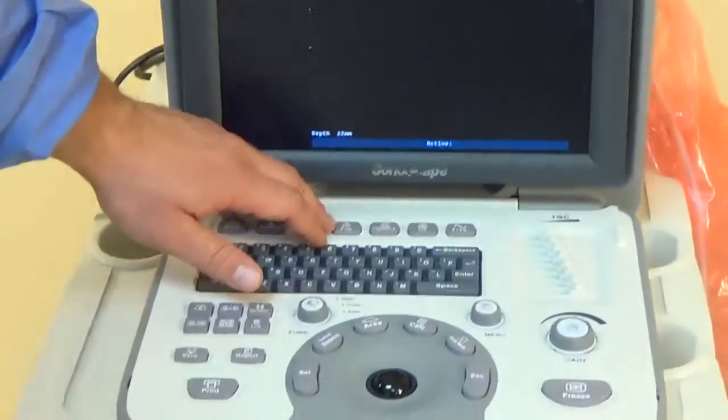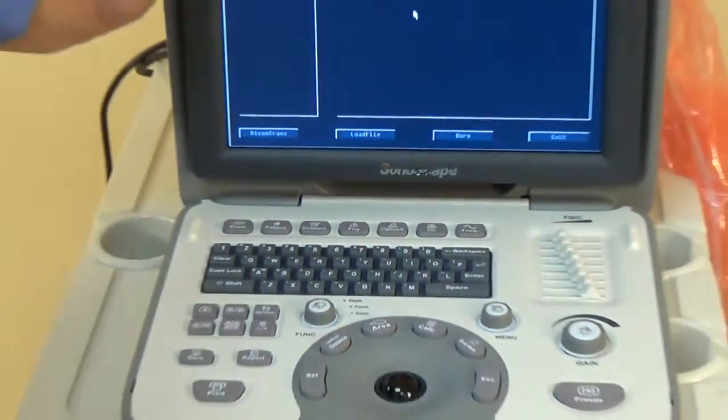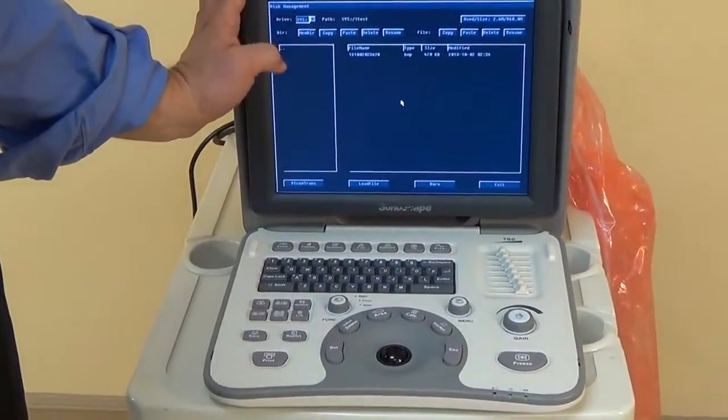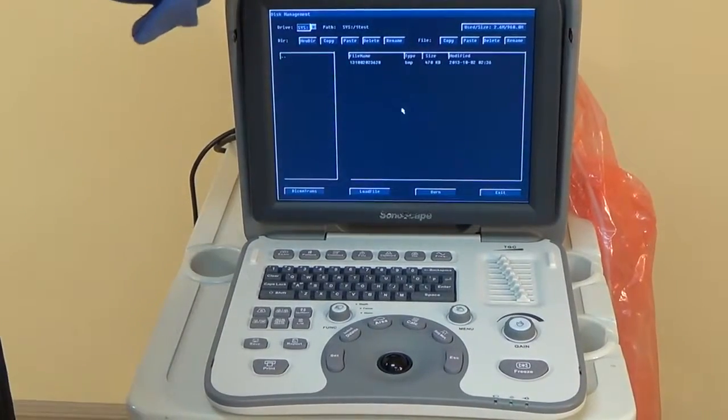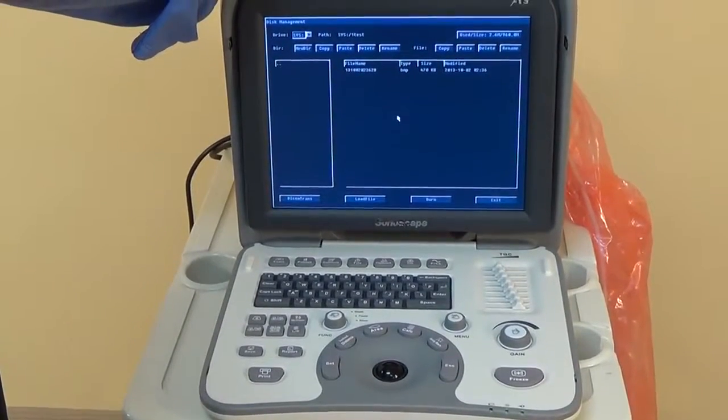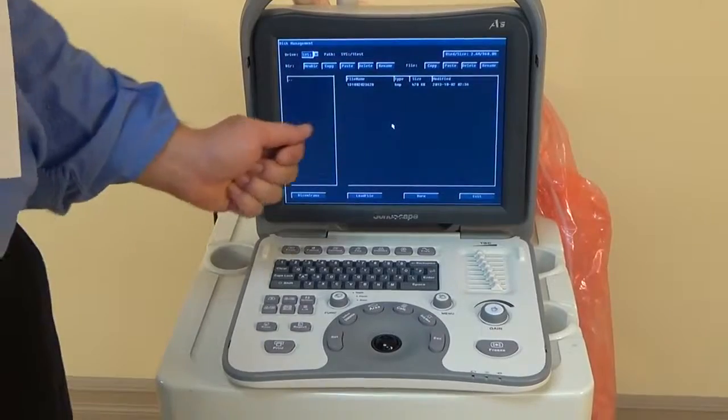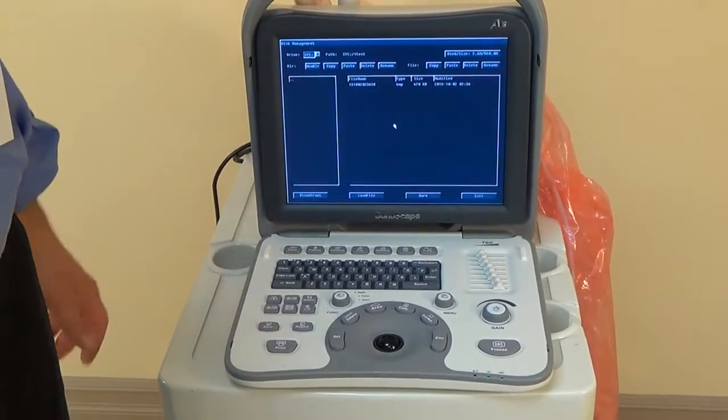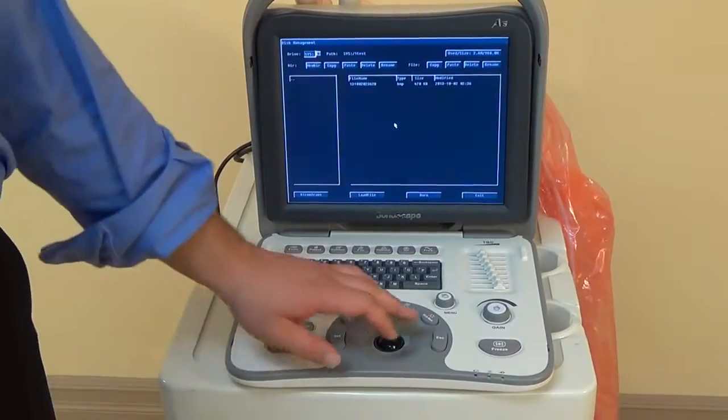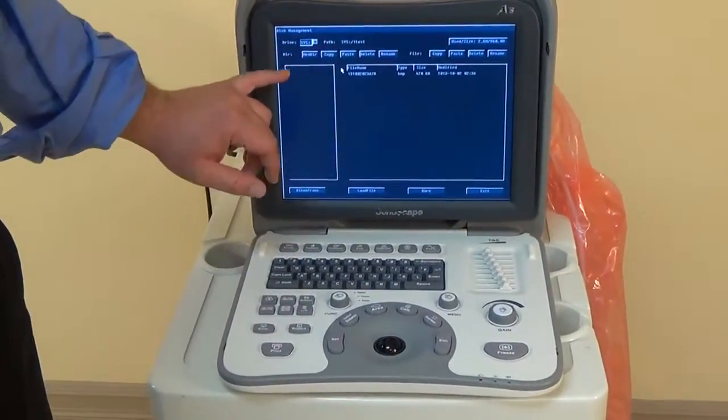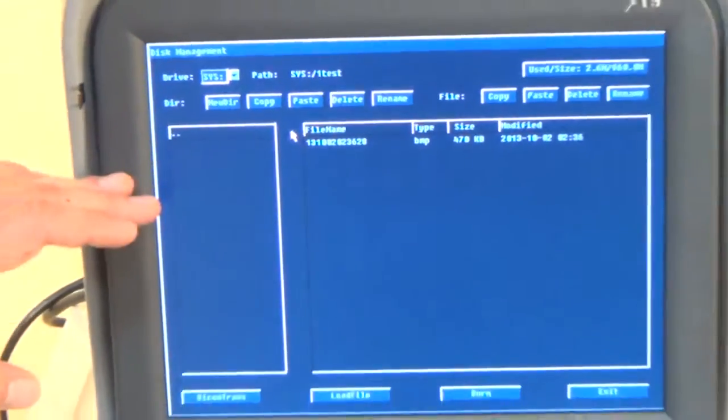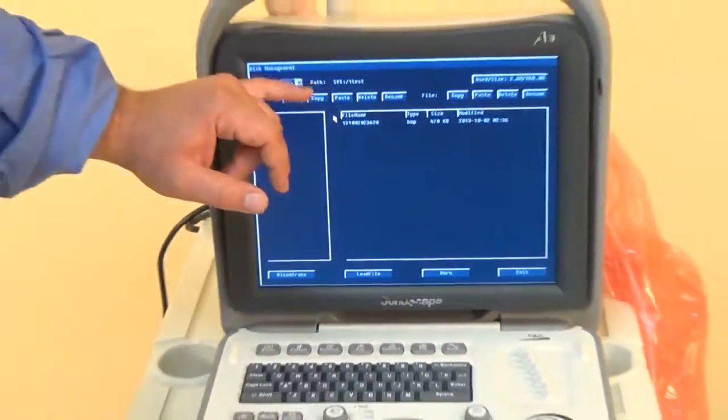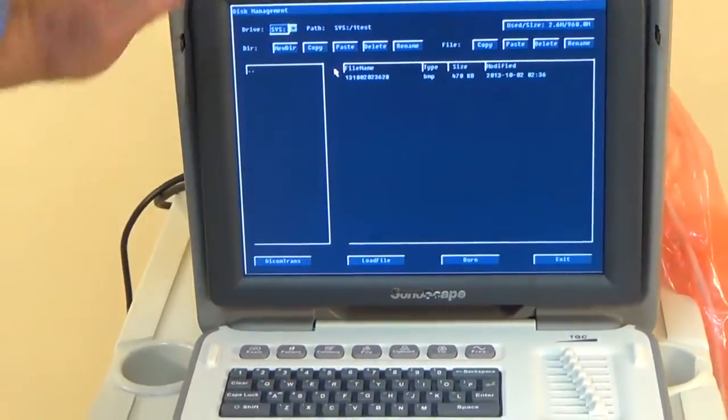File button right here. This button is where you will be saving, storing, and editing all your cases and studies. In this case, you can either save it directly to the computer, or what's really popular by most people is they save it straight to a USB drive. This way you don't have to do anything after you're done except remove the USB, go to another computer, and either send or save or follow up with the images. There's options to create a new directory. So if you have a certain day for a test, you can create that, or a site, and you can have that all under one file.